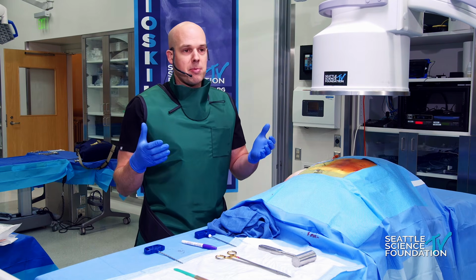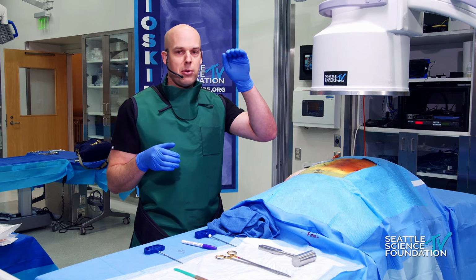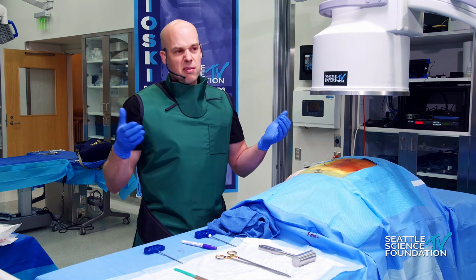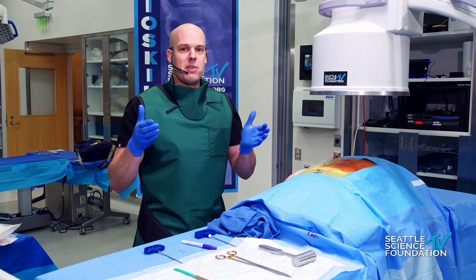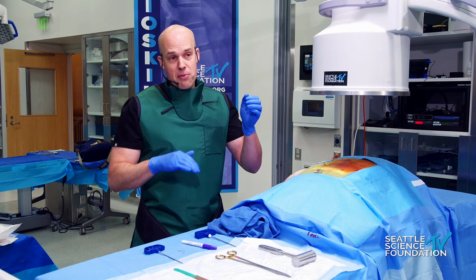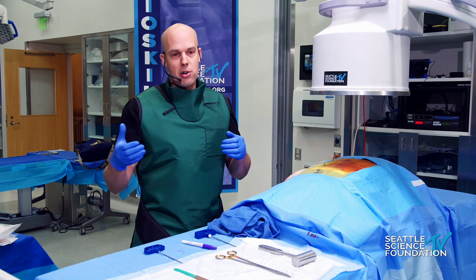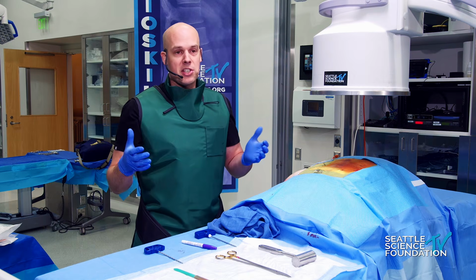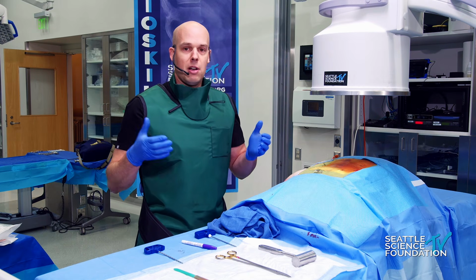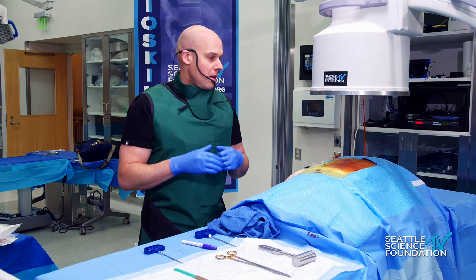But how much cement is that? If you take a look at an L1 vertebral body, you're talking about 33 cc of volume of trabecular bone. That means that you would still need to inject somewhere around 10, 11 cc within that vertebral body to optimize the outcome. And if you're looking at the L5 vertebral body, the average volume is about 45 cc, so a third of that would be 15 cc. That's a full stack of cement. So just as an FYI, you often need to inject a lot of cement to be able to restore the biomechanics and also improve outcome.